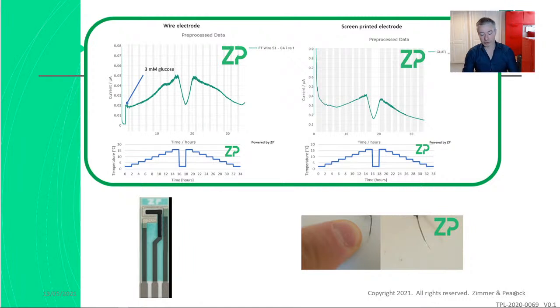Now, a lot of the time this doesn't really matter, because, for example, this is a glucose strip here. That has a temperature effect, but in many environments the temperature is fairly well contained. Let's talk about a European indoor environment: the temperature might go from 18 to 25 degrees Celsius. My temperature range is a little bit misleading, because we're actually going from about 2 degrees to 15 degrees C, which is an unusual range.